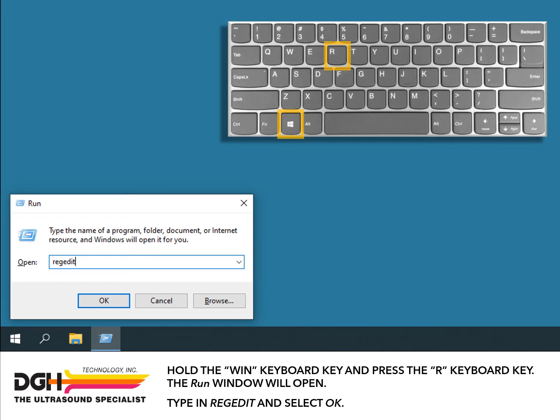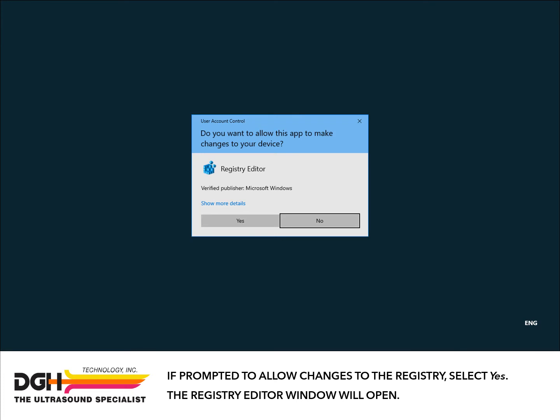Hold the Win keyboard key and press the R keyboard key. The Run window will open. Type in REGEDIT and select OK. If prompted to allow changes to the registry, select Yes. The Registry Editor window will open.